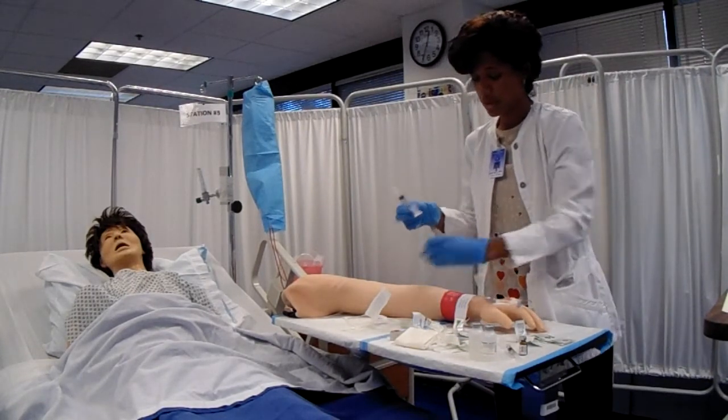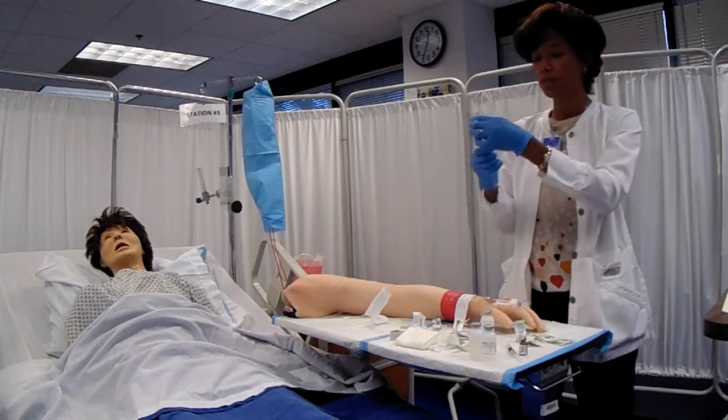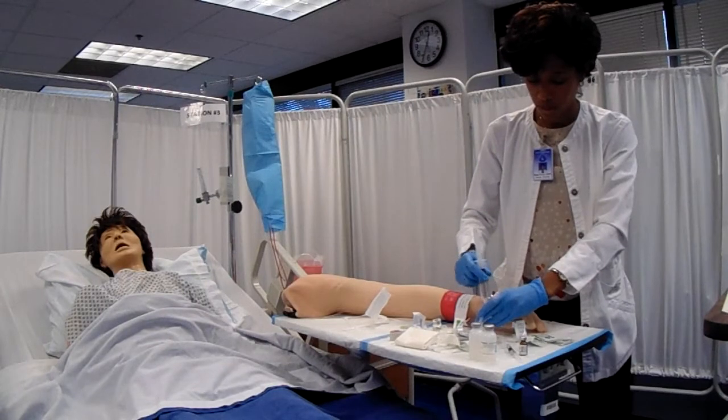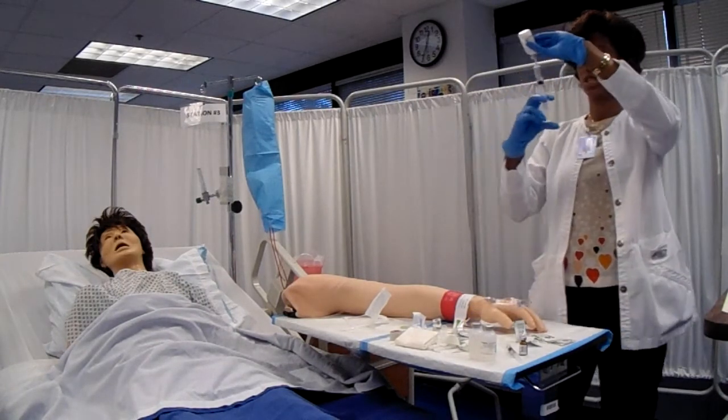And I'm going to go ahead and scrub the top of my flush, and I'm going to be pulling up 10 mLs. This is to provide for flushing before and after medication administration.